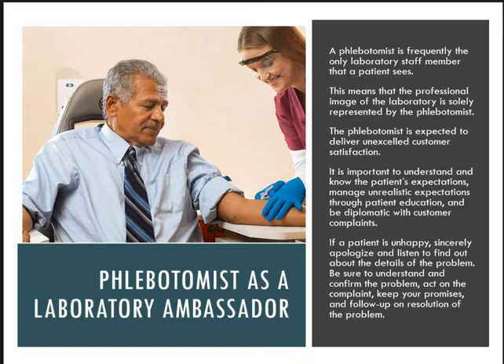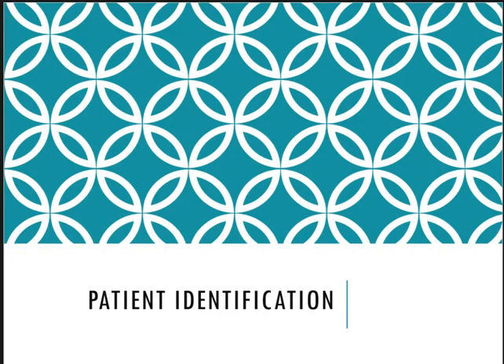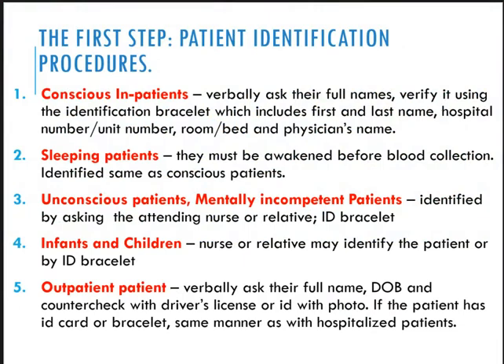And then next one, let's move on to our patient identification. This is the most important aspect in specimen collection. Okay, what if the laboratory request for patient A is named, for example, Wong Farida, but then ang imuhang nakuhaan kay si Wong Forido, right? So that's another criteria to reject the specimen. So mukuha na pagkausab. Okay. Now the first step is the patient identification.